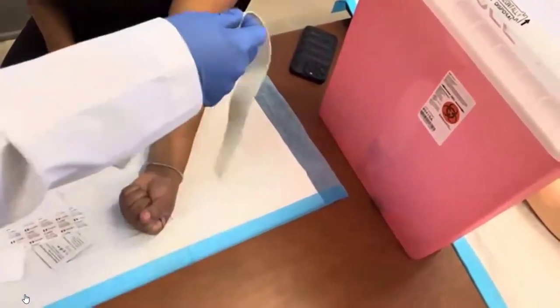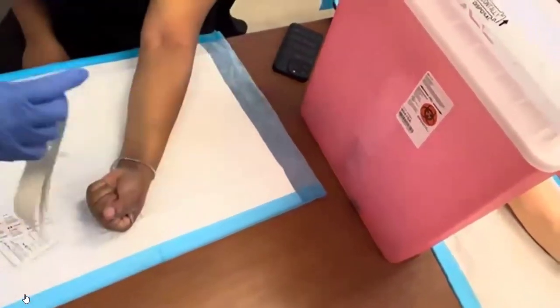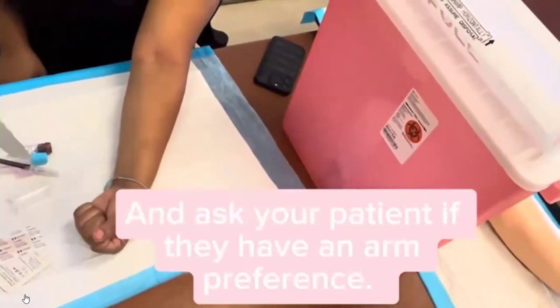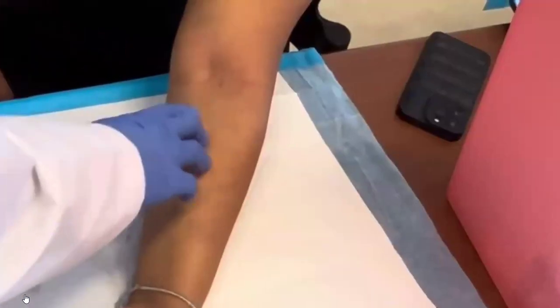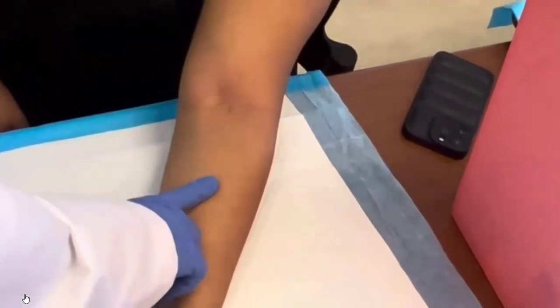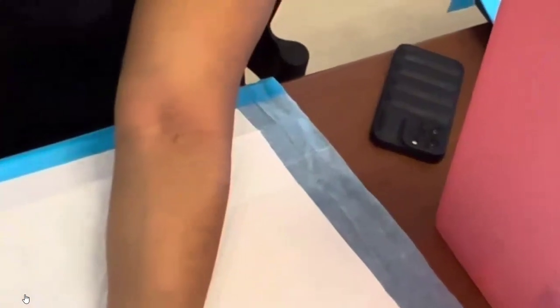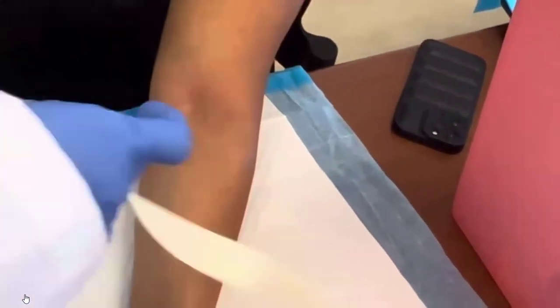Now I'm going to put my tourniquet on. In real life, you want to check both arms and go for whichever arm is the best. But I already know I'm going to go here. If you look at her arm, she has a beautiful vein. This is the type of person that when they come in the lab, you are very happy because it's a very good vein. Everybody is not going to be like that, but in this case, she has a very good vein. So I'm going to tie the tourniquet on.